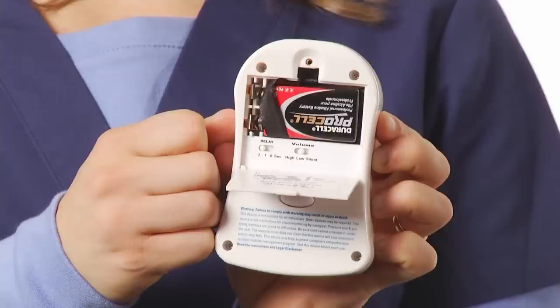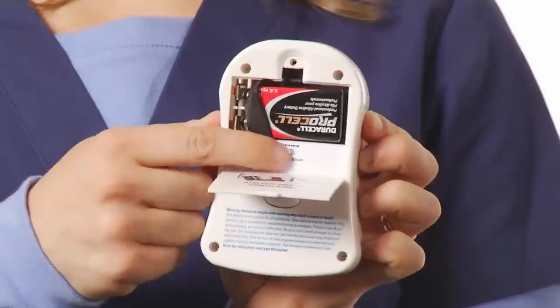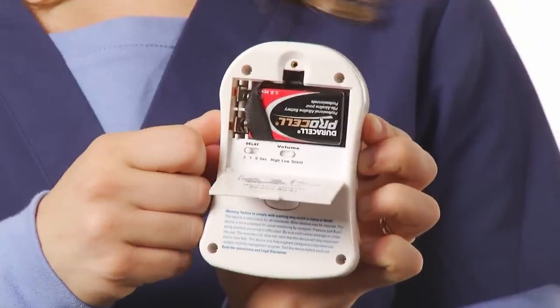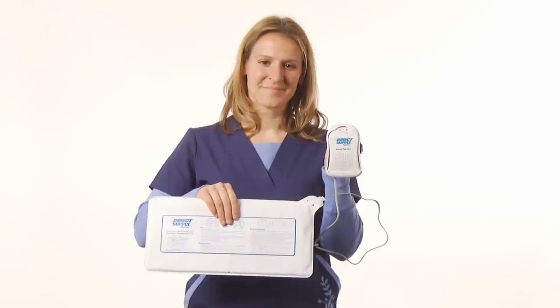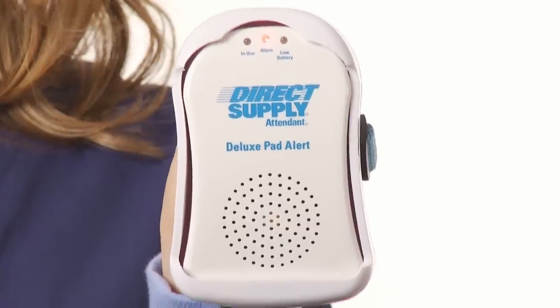If you wish to silence the alarm at the bedside, simply turn your volume setting to silent, and alerts will only sound through the call system. Test the alarm functionality by pinching and releasing pressure from the pad.